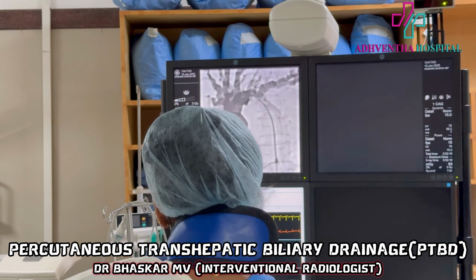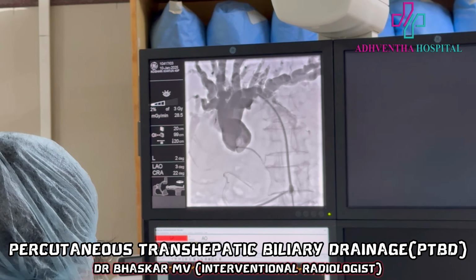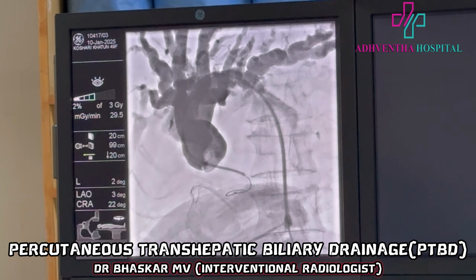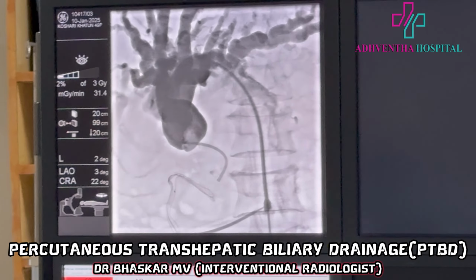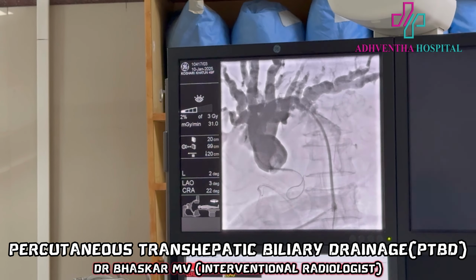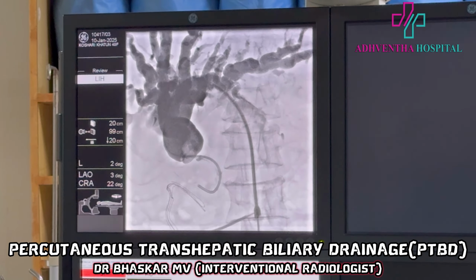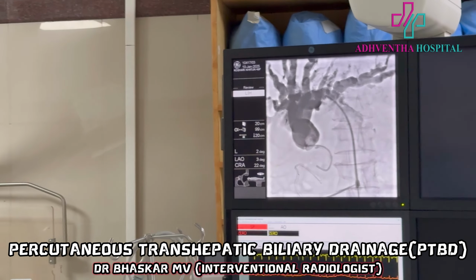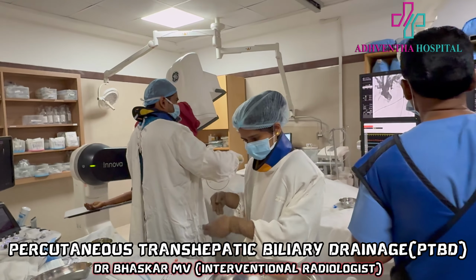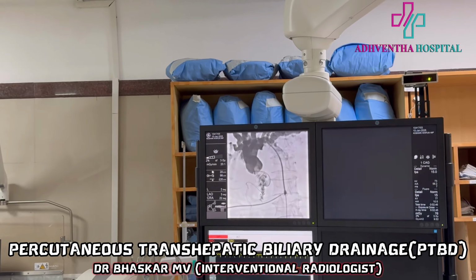So once the wire goes, your catheter should go and then guide it. Let's see where it's going. I think that's an obstruction. Can be gallbladder, we can confirm that. Remove the wire. Contrast. Can inject a little contrast and confirm. Yeah, we are already in the duodenum.